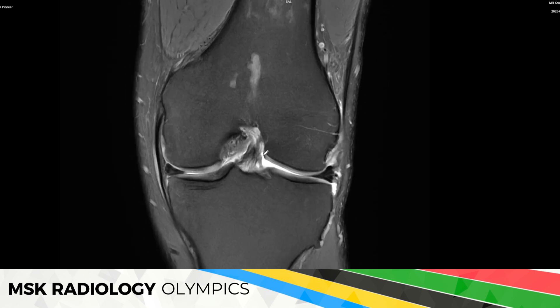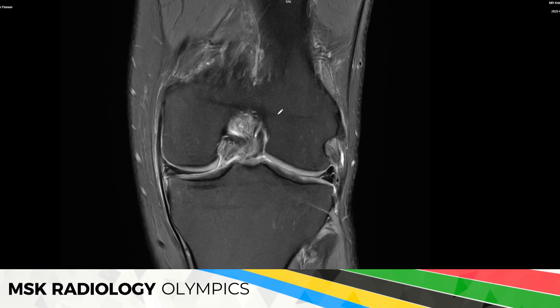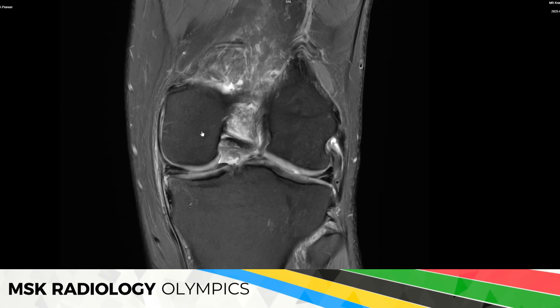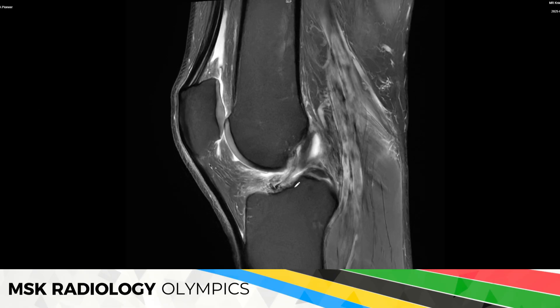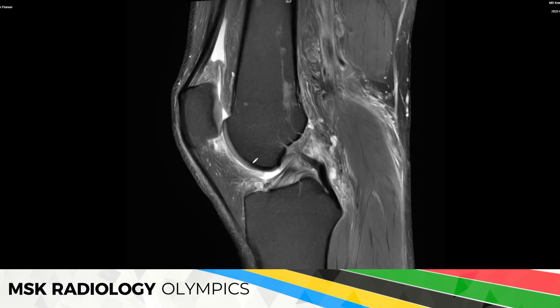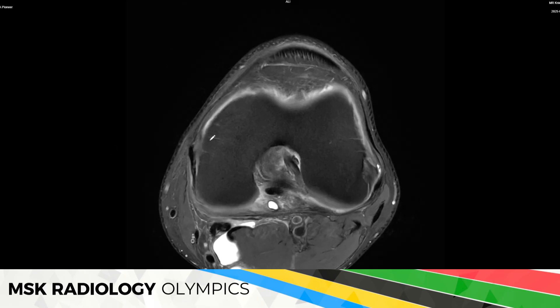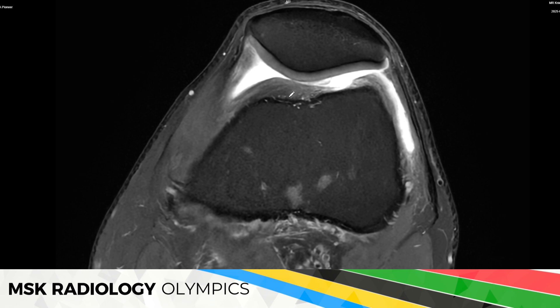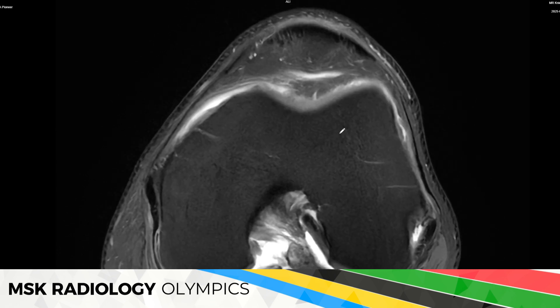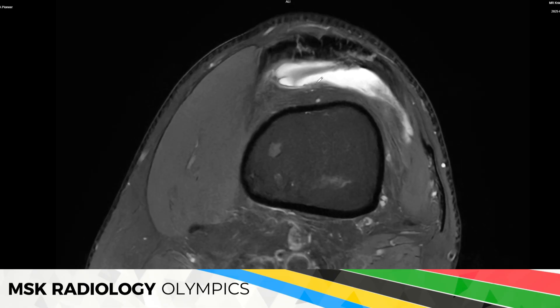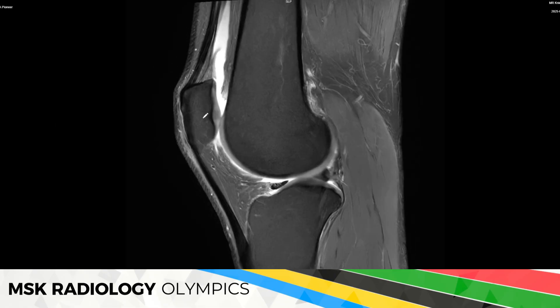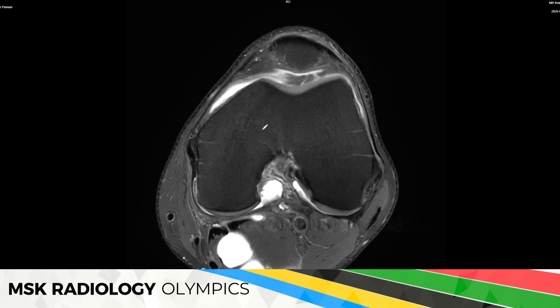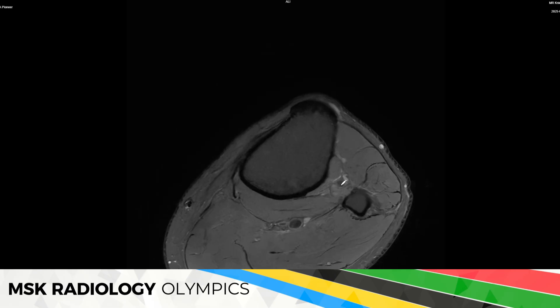Moving centrally: the ACL is continuous, we don't see any major pathology, it is certainly not torn. Given the patient's age and no history of trauma, I wouldn't call an injury here. The PCL is also fine. In the patellofemoral compartment, there is a little bit of edema in the cartilage and some very superficial fraying, but the patellar cartilage is otherwise okay. The trochlear cartilage is fine. There's a tiny bit of fluid in the suprapatellar recess. Extensor tendons are okay and the fat pad looks unremarkable.